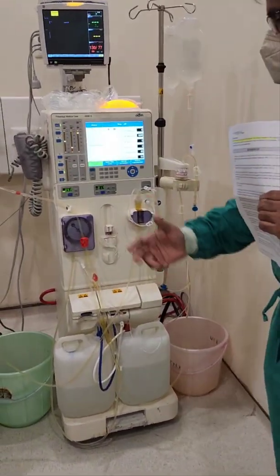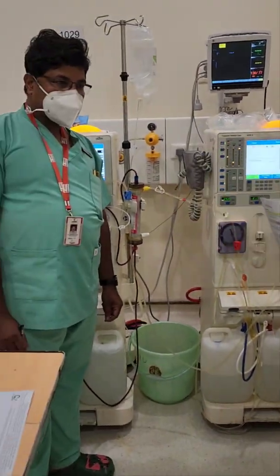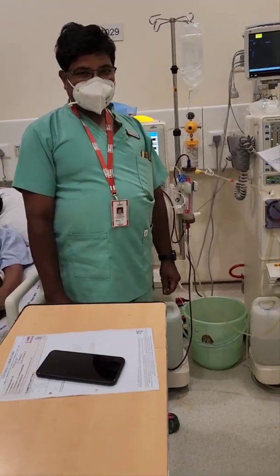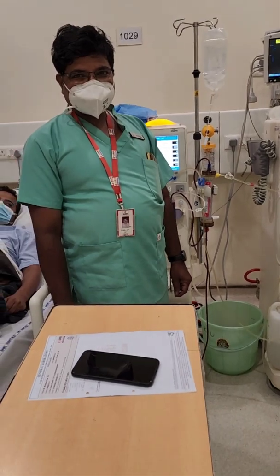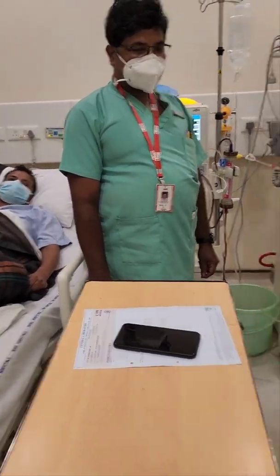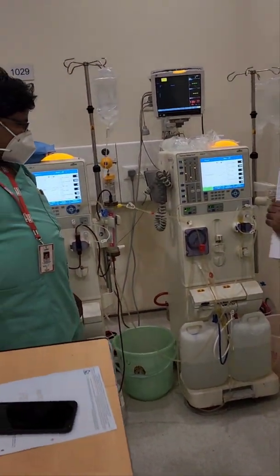Here we have our very expert dialysis technician — the most senior dialysis technician we have in the city and in our state. Together we will basically walk you through this procedure. So go ahead and tell our viewers about it.